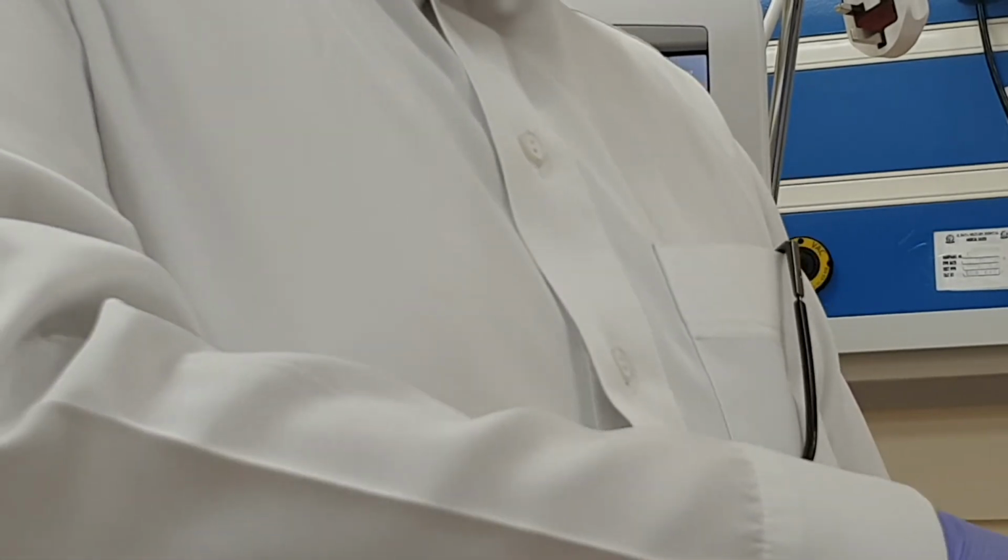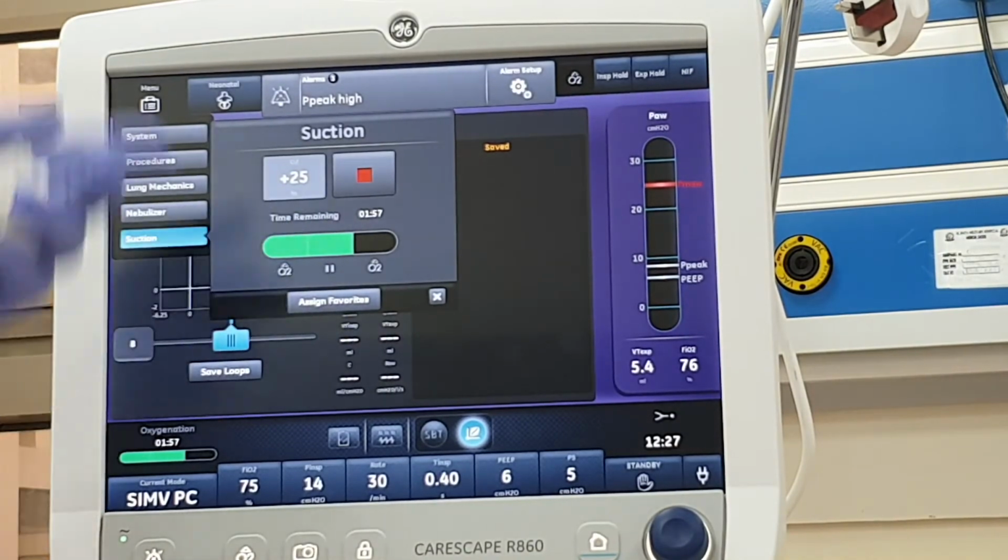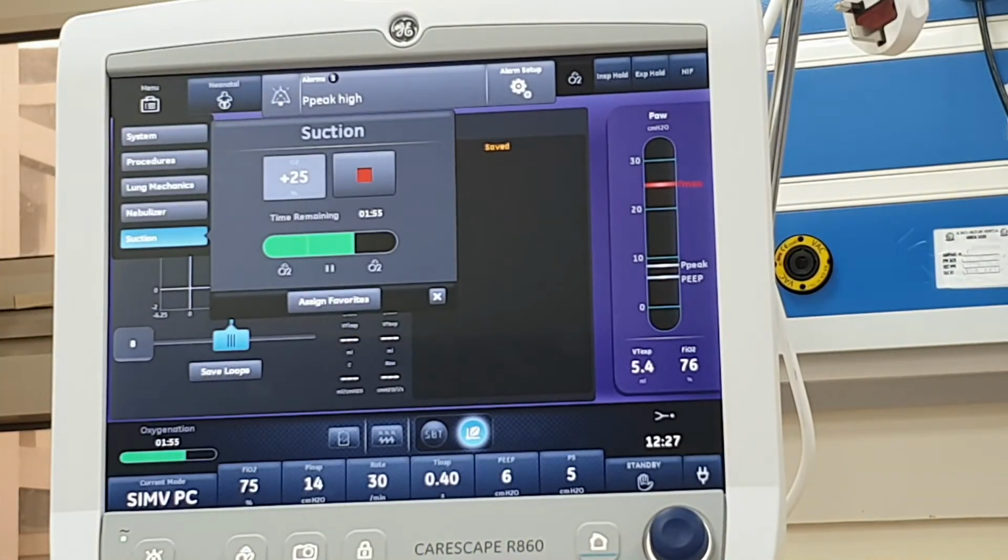You see. So if there is flow, what would happen? A lot of water comes to your face, and infection and a lot of problems. So it basically stops it from throwing flow at your face and at the caregiver. Then when you finish that period, it goes to a pre-oxygenation and post-oxygenation period. And it makes your suctioning easy, no alarms, nothing.